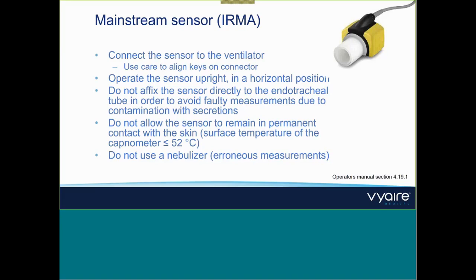And do not use a nebulizer. I get the question very often: can we use it, why can't we? It's not prohibited. You can use a nebulizer, but you should be aware that there will be erroneous measurement during that time, and depending on the drug you are using, this could also have an effect on the adapter, so that you might have to change the adapter after nebulization. But nothing bad is happening to the patient, but your measurement will potentially be erroneous.